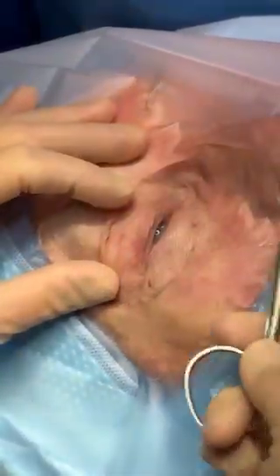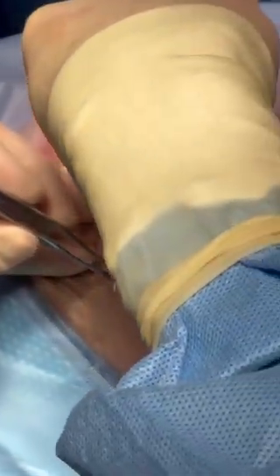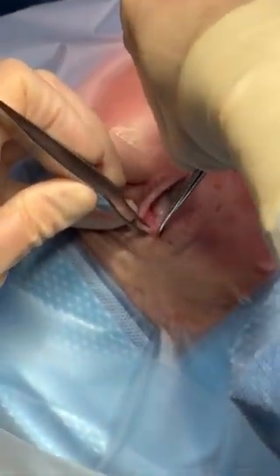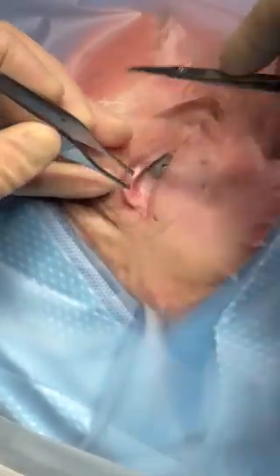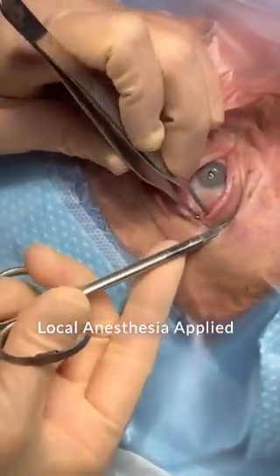More likely in an emergency setting, the instrumentation is not going to be dainty and can end up looking more like this. It's cutting right down toward the lateral periosteum. Next, the inferior crus is released.